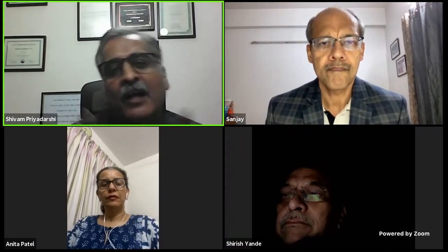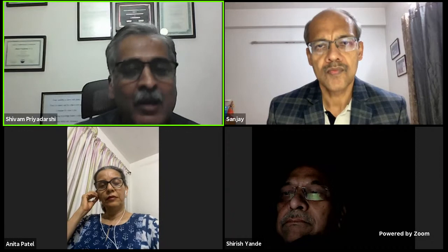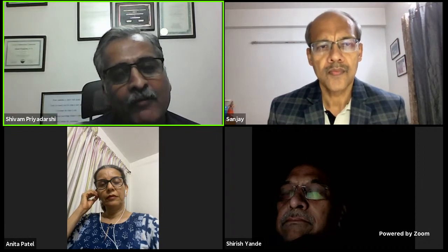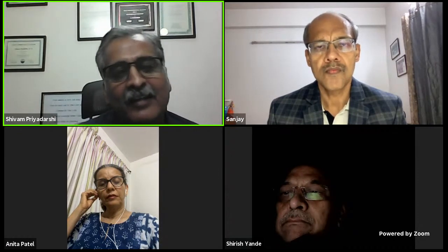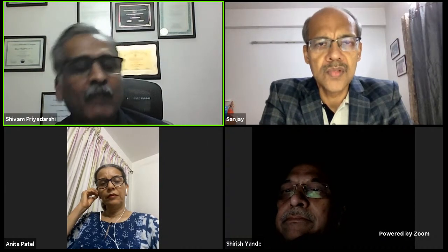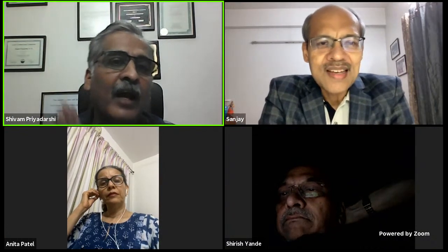So what do you think, because urodynamics in any way is an expensive investigation, it's time consuming, it's cumbersome, and you may not get a good result if you do not have a very dedicated team. So what about the non-invasive urodynamic studies? And what do you think could be the role of non-invasive urodynamics in future? Like the ultrasound cystodynamogram with bladder wall thickness, the bladder weight, and the IPP. And then we have other things like penile cuff, urethral devices, and even Doppler ultrasound to measure the intravesical pressure. So what do you think could be the role? Because they could be a simpler, non-invasive way to at least select a very specific population where we need to go to a urodynamic.